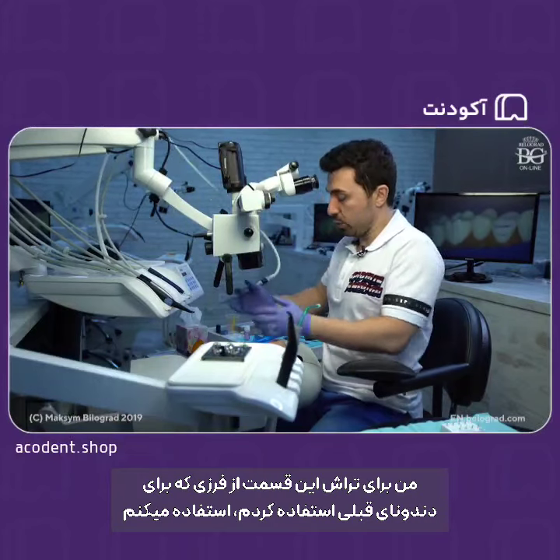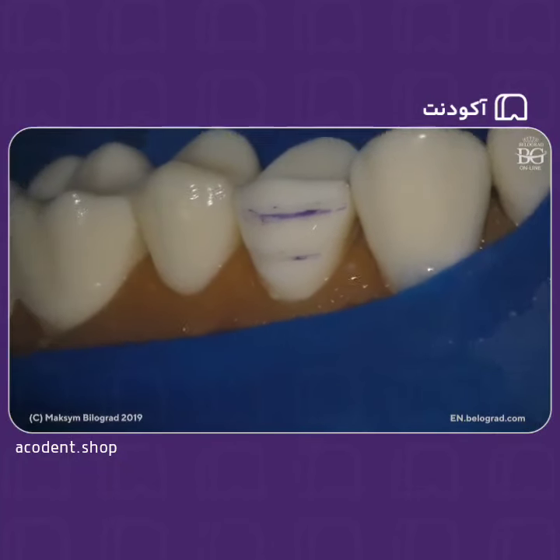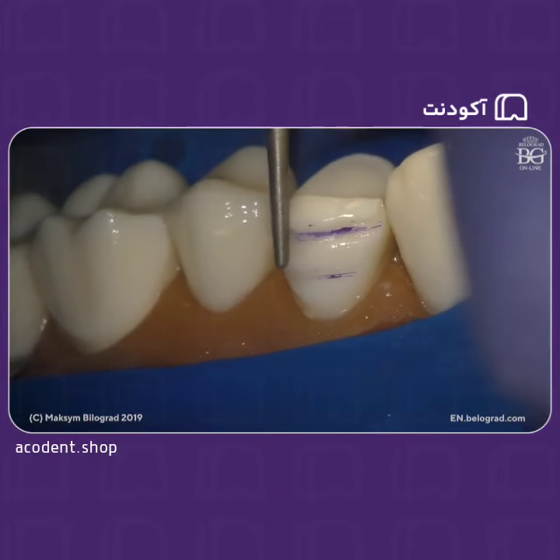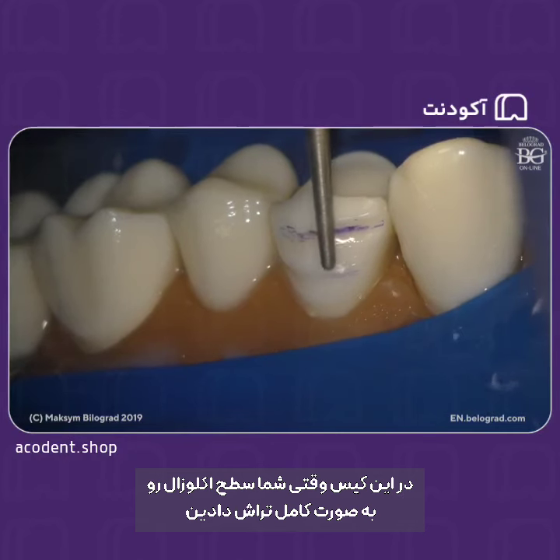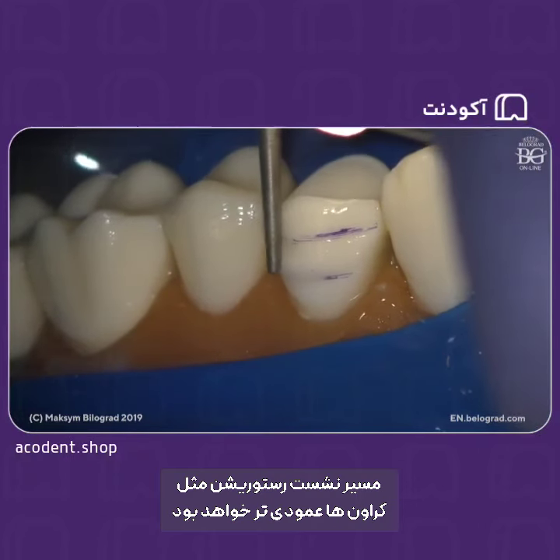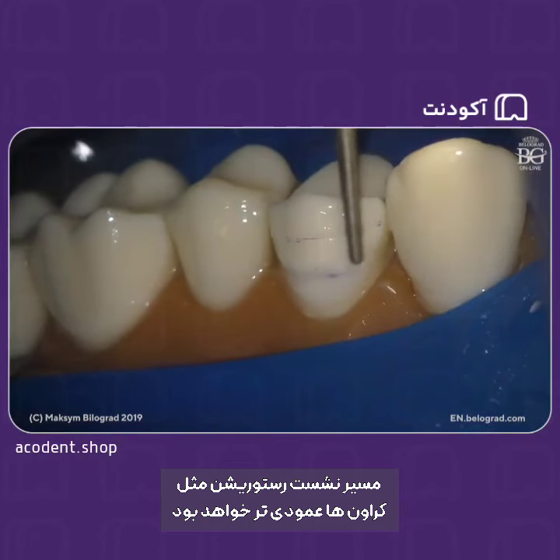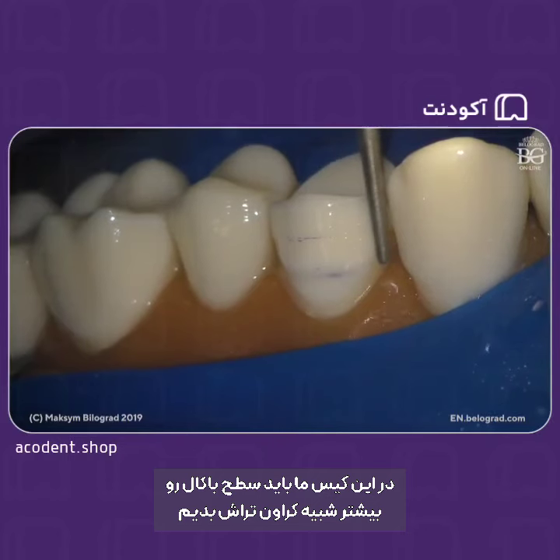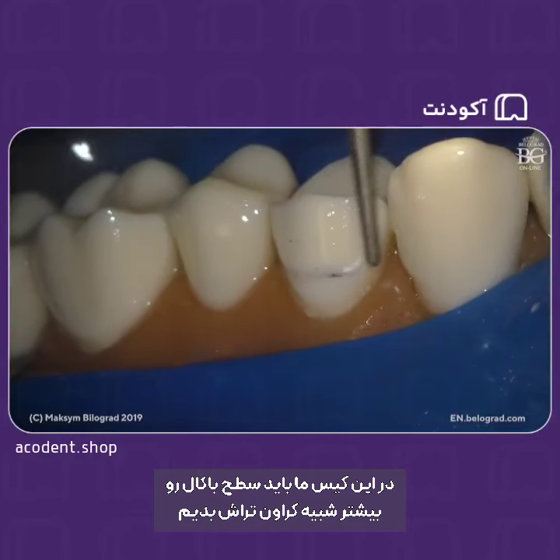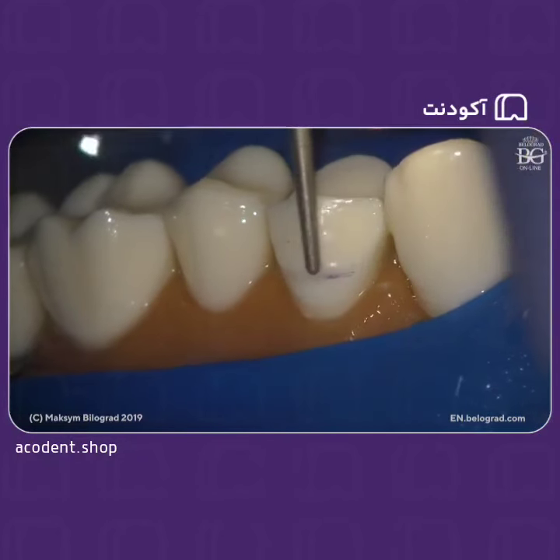Okay, and the same burr as I used for previous teeth, this tapered, number 16, incisal plane. In this case, when you have prepped the full occlusal surface, the pathway of insertion for the restoration will be more vertical, like a crown. So in this case we have to prep the buccal surface more like a crown. So basically two planes. There will be a two plane preparation.